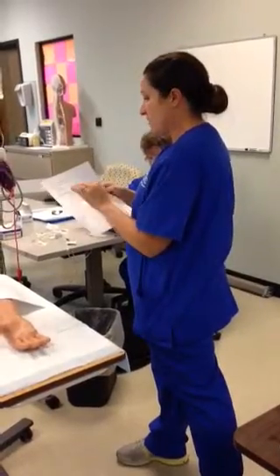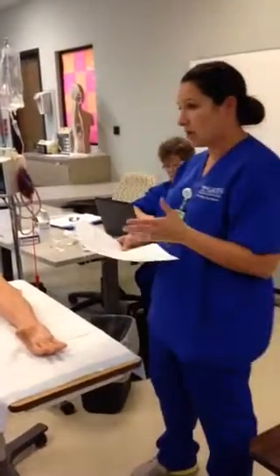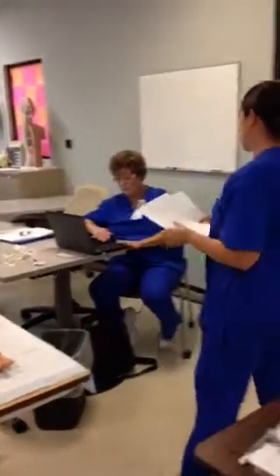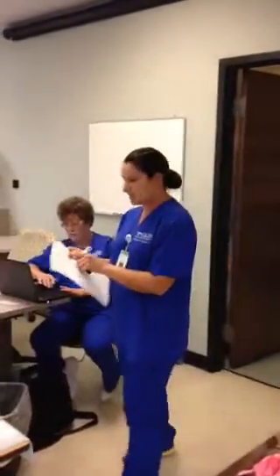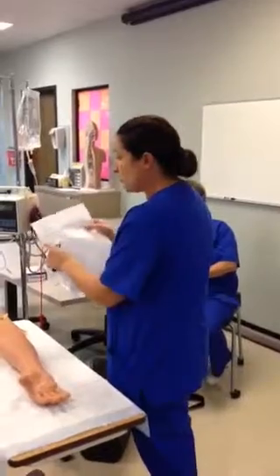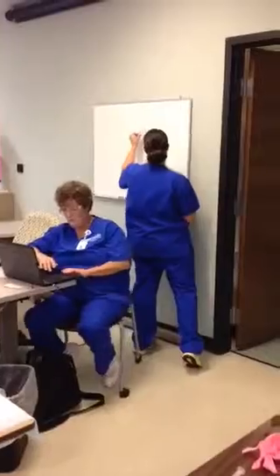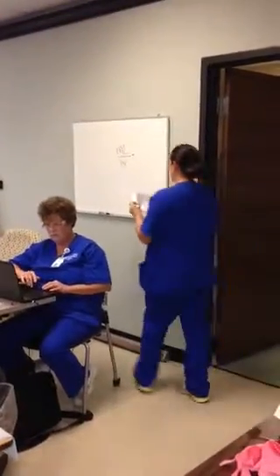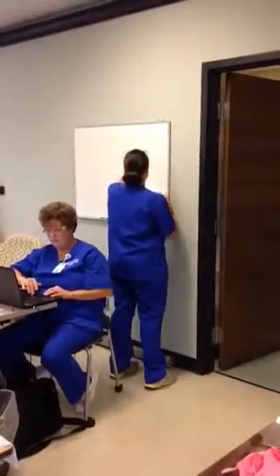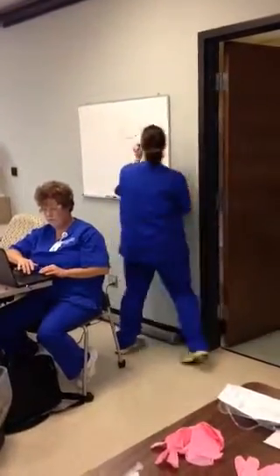Calculate the correct IV piggyback infusion rate using a pump. I have to look at my MAR to see how this is mixed. So I have Cleocin 300 milligrams in 100 mils. Since it says utilizing an IV pump, I know I'm looking for mils per hour. If it gave me a drop factor, I would know I had to calculate drops per minute. So I've got 100 mils over, it says that it must infuse over 1 hour.